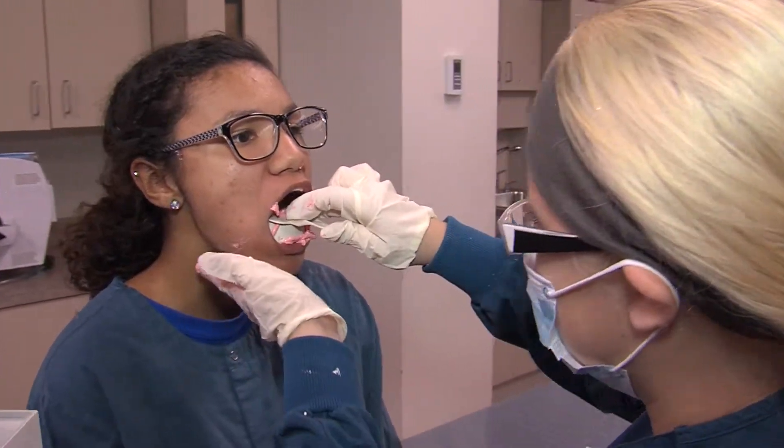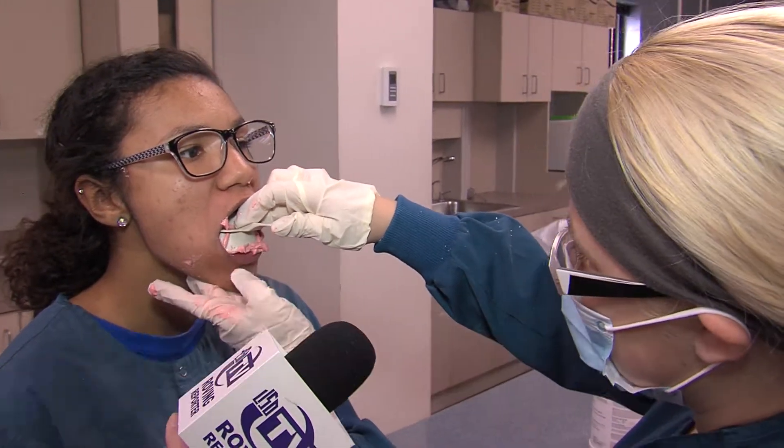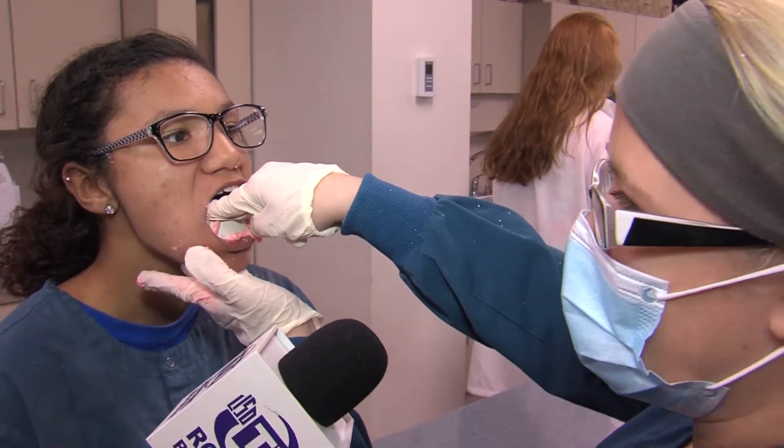So what are you doing now to make sure that it's in the right spot? You want to line it up. There's a little ridge right here, and then you want to make sure they say "ooh" so their lip goes over the plate, and then make sure you press in the back hard enough so you can get all of them in there.